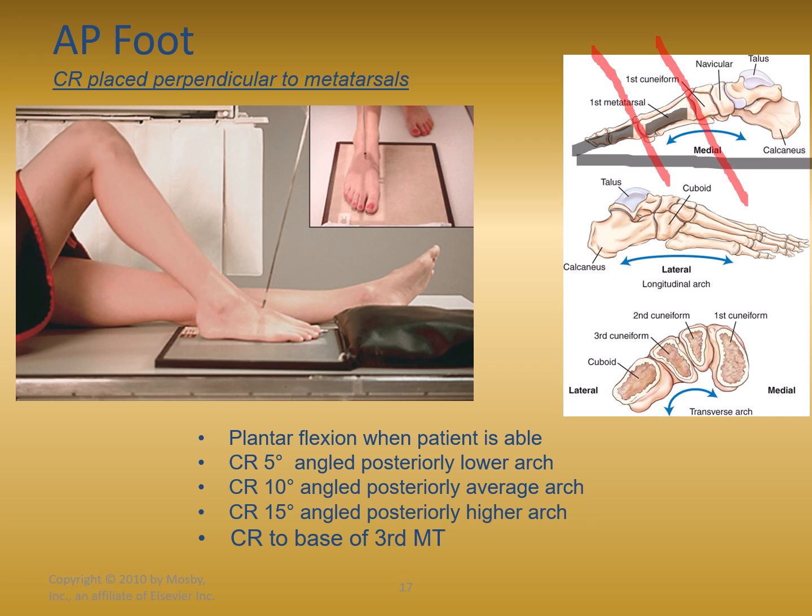All right. So that is the purpose of this angle that we're seeing on the tube that they put here. Right? They put that angle on the tube to show you. Now they describe this as being perpendicular to the metatarsals. So if I put a line down those metatarsals, you can see how that red line, which is our central ray placement, hits those metatarsals perpendicular.